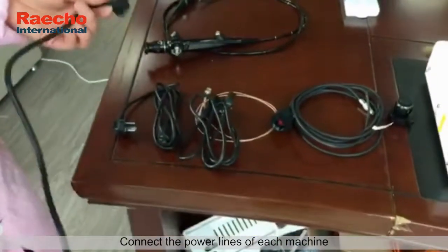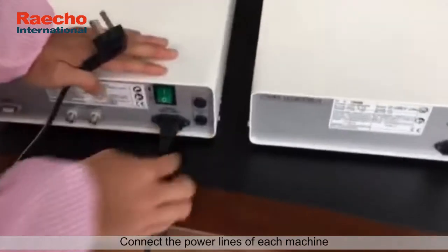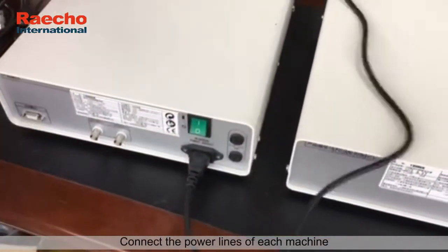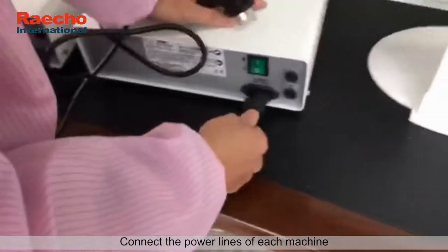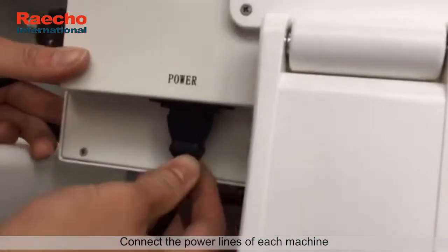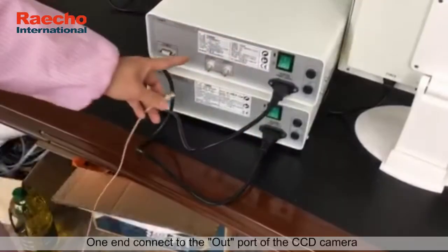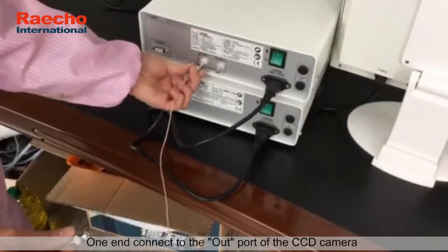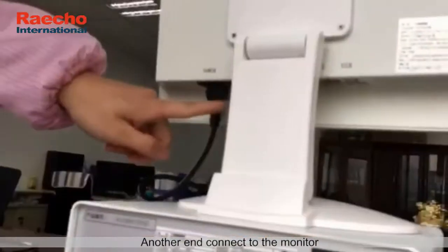Connect the power lines of each machine. Connect the signal line — one end connects to the output port of the CCD camera, another end connects to the monitor.